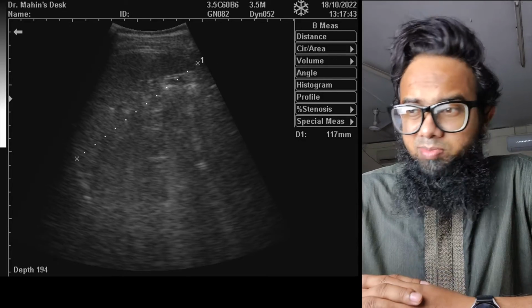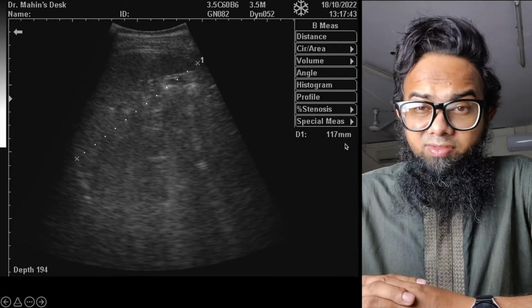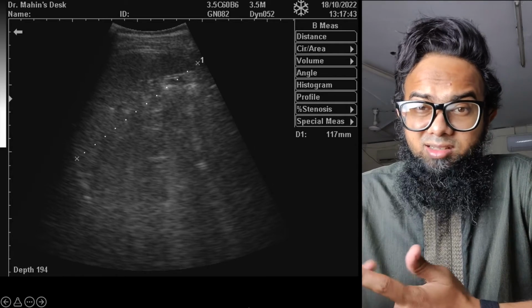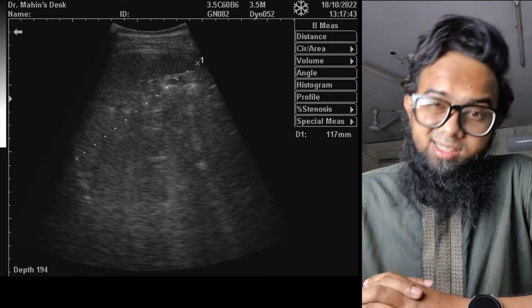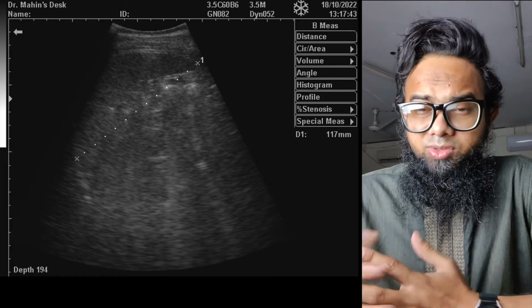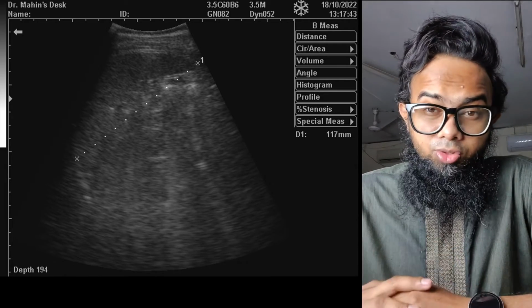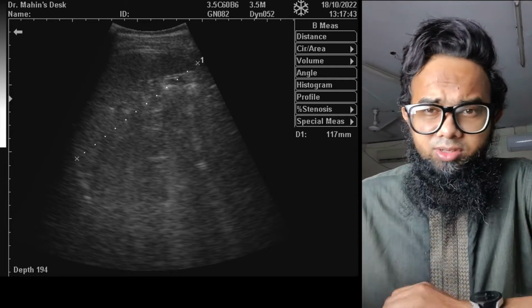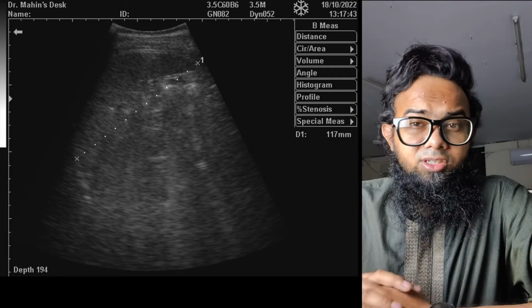This is the picture of my spleen. It was 11.7 centimeter on that day, which is quite high for me because my normal spleen size is around 8 centimeter. That's quite a splenomegaly for me, though in most cases we would see it as a prominent spleen. And if you compare the body height, then you can say whatever you want. These were the features of plasma leakage.